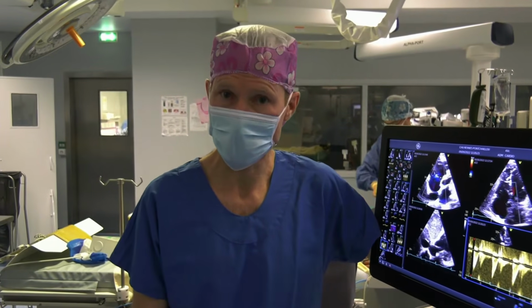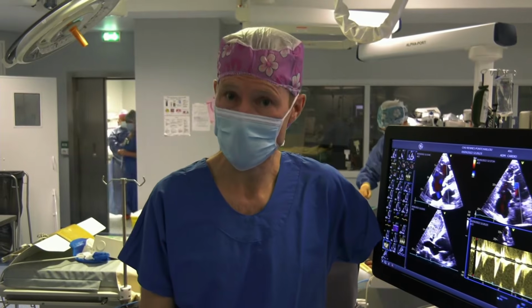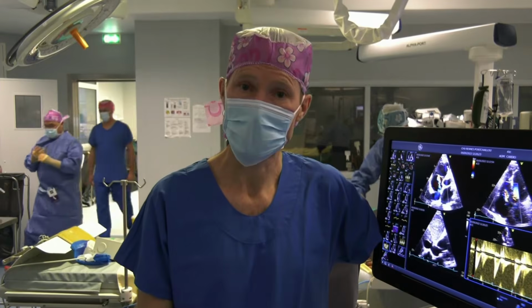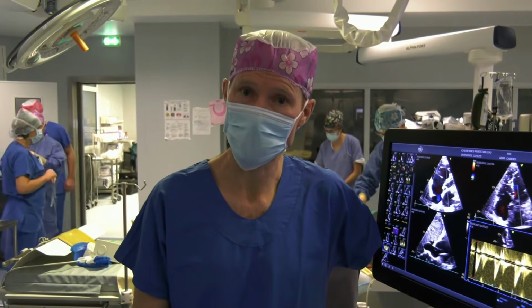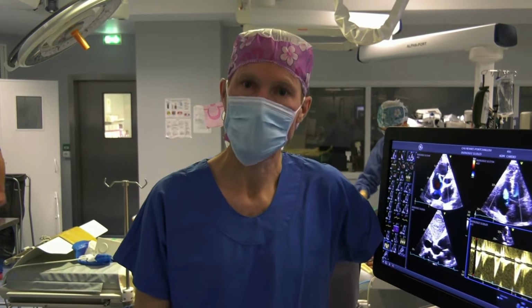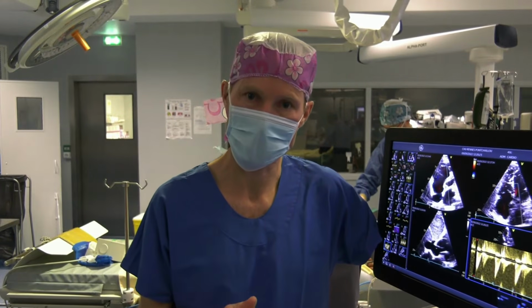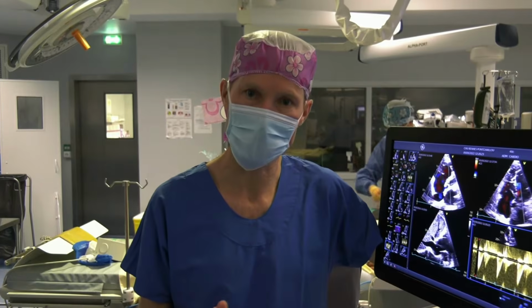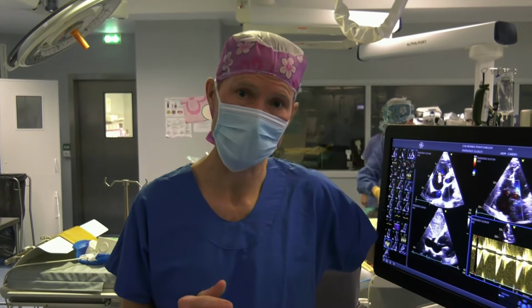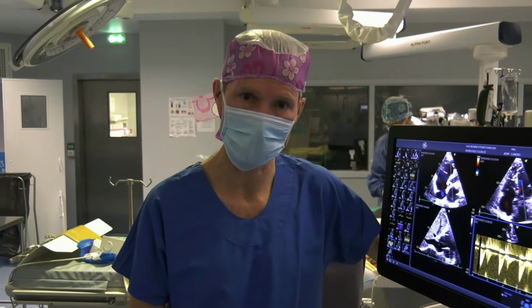The patient is symptomatic, but we had checked before that the patient has normal pulmonary pressure. It means that we did a right catheterization. We checked the echoes several times, looking at the pressures, the volemia, the right ventricular function and the degree of the tricuspid regurgitation.